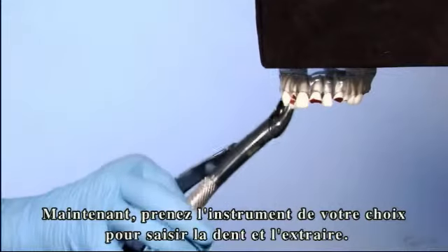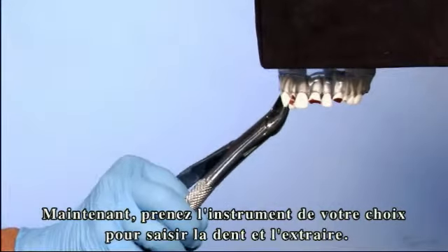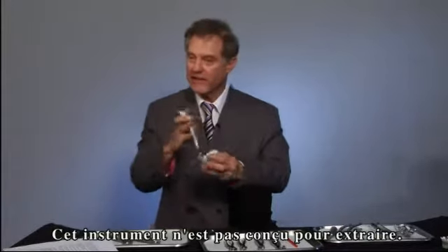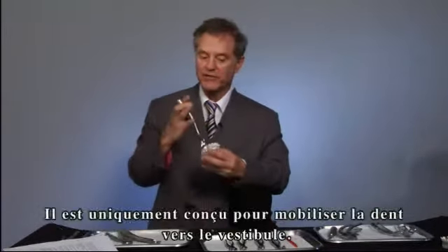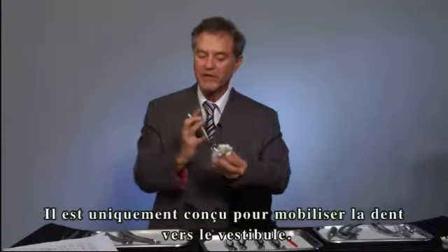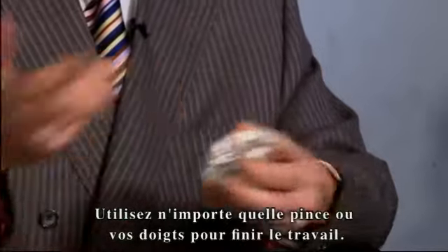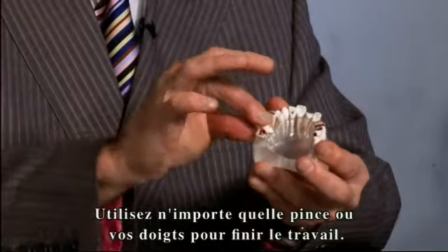Now you can use an instrument of choice to grasp and remove the tooth from the socket. In all extractions, the instrument is not designed to take the tooth out completely. It's designed to move the tooth buccally — stop — then use a rongeur, use a hemostat, or use your fingers and take the tooth out the rest of the way.